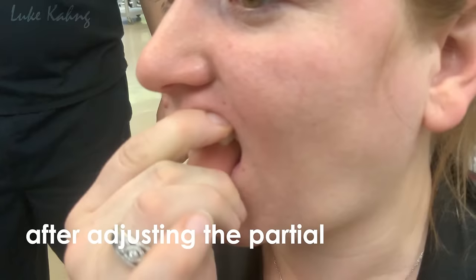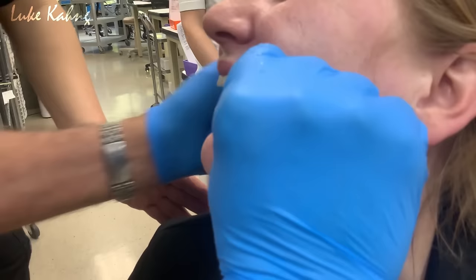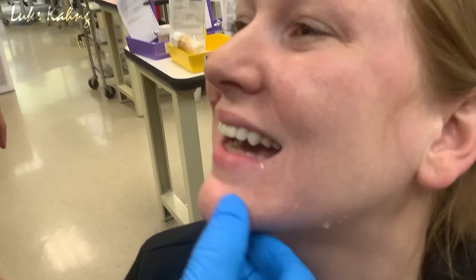Is it hitting? It's a little loose? Oh, wait, it's tiny in the way. No, no, come here, wait, okay, here. Okay, we have to tighten it. Bite down. Is it hitting there still? No. Okay, let me tighten it up now.